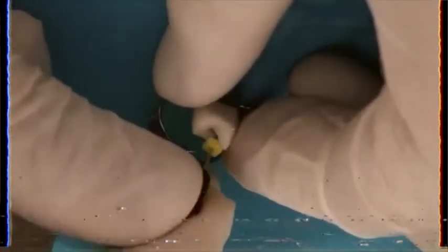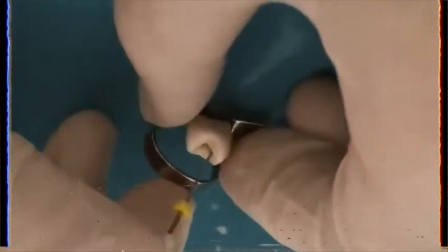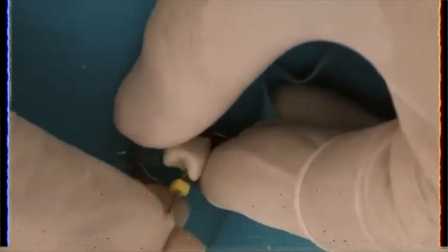We will now use size 40, the previous file size, to recapitulate, to remove dentinal mud, and also to form the good tapering of the root canal internal anatomy. Thanks to our recapitulation, our file size 45 can now fit to the desired working length. We can now negotiate the file even further and reshape the internal anatomy of the canal.